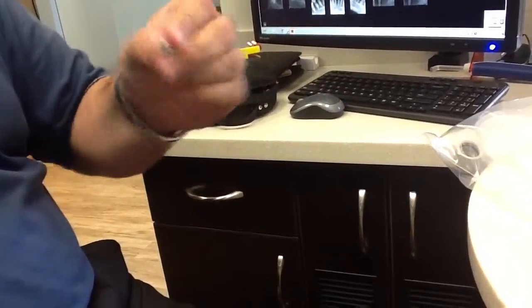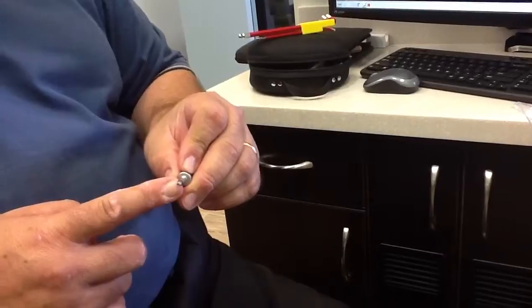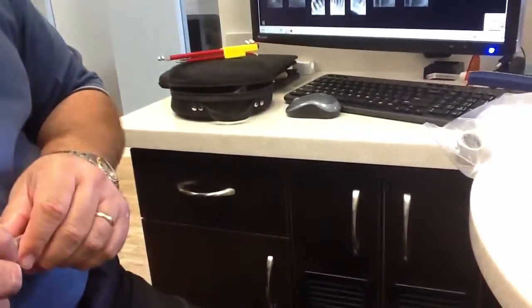because if they get bent or break, sometimes it becomes very difficult to get that little stem out of the body of the unit itself, and only have the one for whatever water adjustment on a high speed I normally would have. Okay, so what would you call this part of the unit? This is the main control unit.